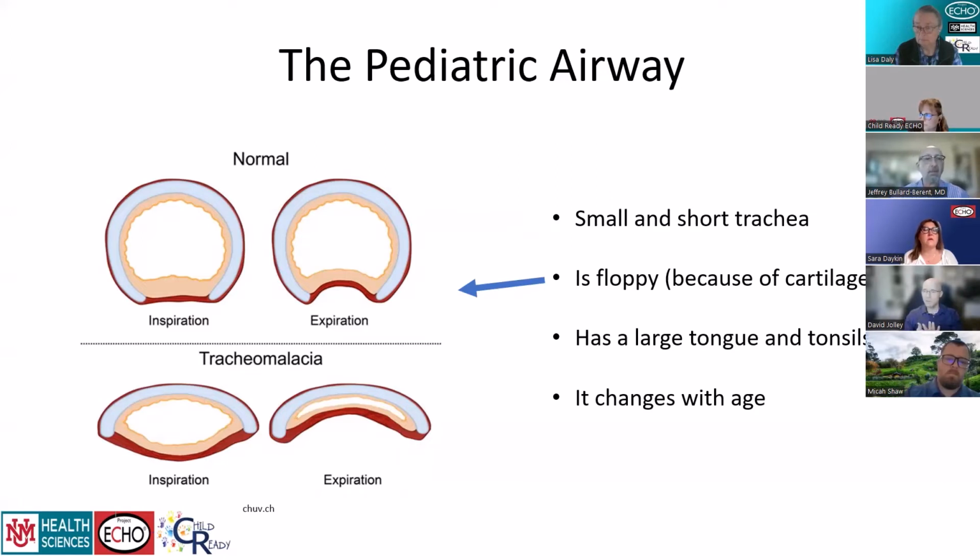when it comes to bag valve mask ventilation, in that children respond so well to it for a variety of different problems. It's also why the most important skill that anyone can learn that has to care for a child who's having an airway emergency is bag valve mask ventilation. With that skill alone, you can save that child's life. Endotracheal intubation is cool, but bag valve mask ventilation will save lives. Next slide.